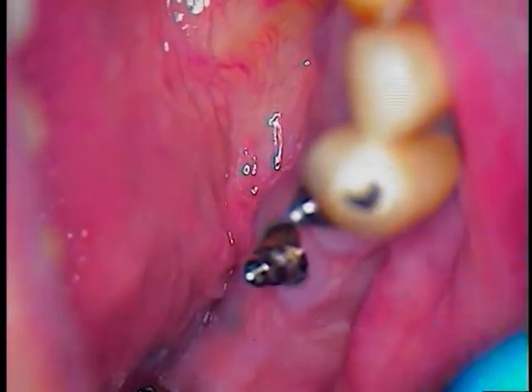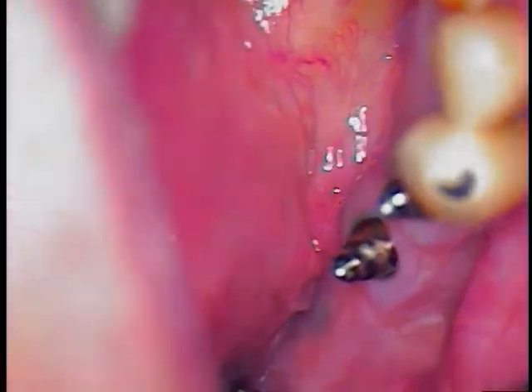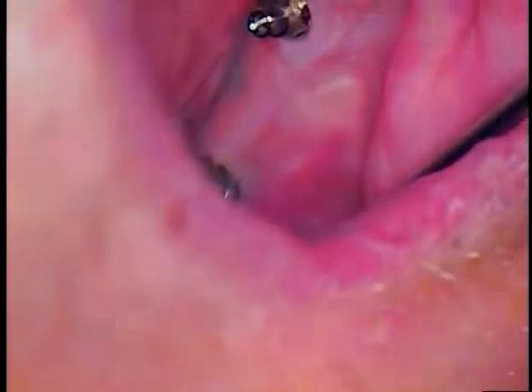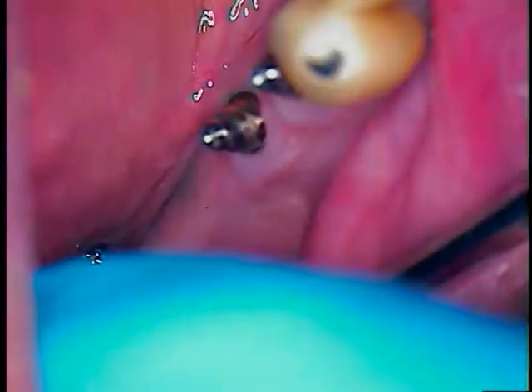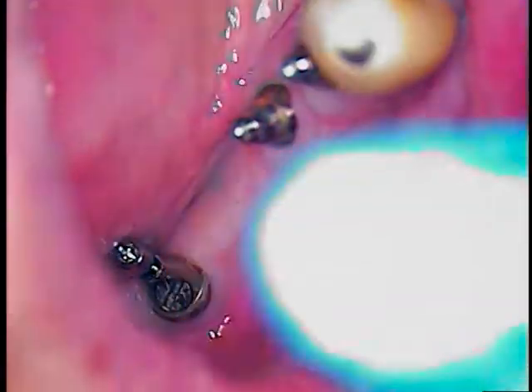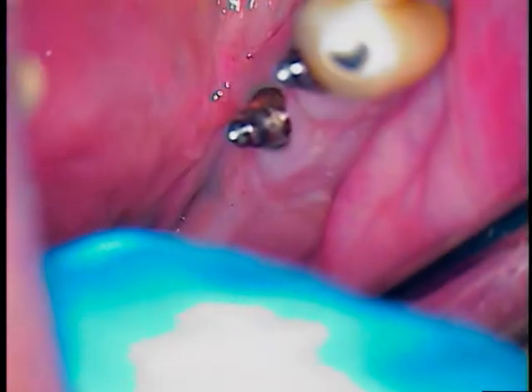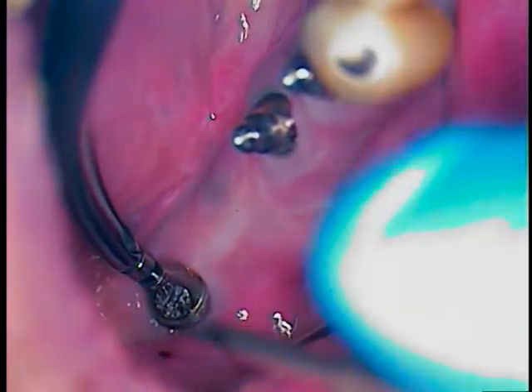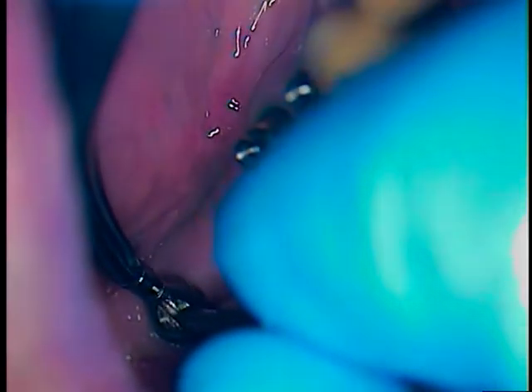Just grabbing tissue only. I'm going to come in and hold the top of the abutment down. I placed the prosthetic screw for a reason — I just wanted to keep that in there as a holding device. This is all just going to be hand tightening on an angled abutment, holding it down.